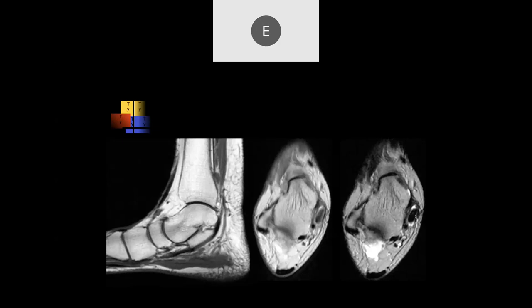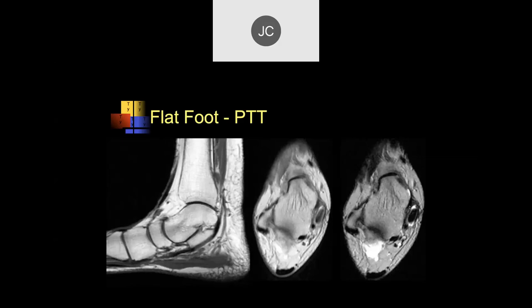The rule of thumb is that the posterior tibialis tendon shouldn't be larger than the sum of the cross-sectional areas of the two other tendons here, so this is definitely large. The capsule is probably a little bit thickened, there's fluid around it, so this is posterior tibialis tendinopathy associated with flat foot deformity. You get this when the posterior tibialis tendon is no longer functional and you don't get proper support of the arch of the ankle.